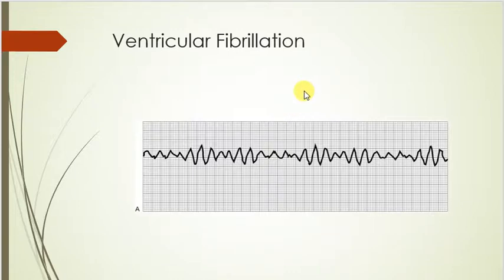So my thing is CPR. Boom. We've got to do CPR, call the code, and get the crash cart in there, because the only thing that will fix VFib is defibrillation, not synchronized cardioversion. That means we're going to give them a little bit of Alabama power, and we are going to try to shock this rhythm out.